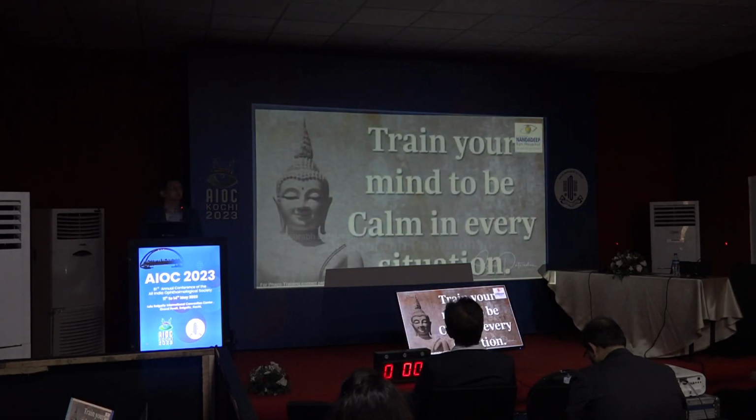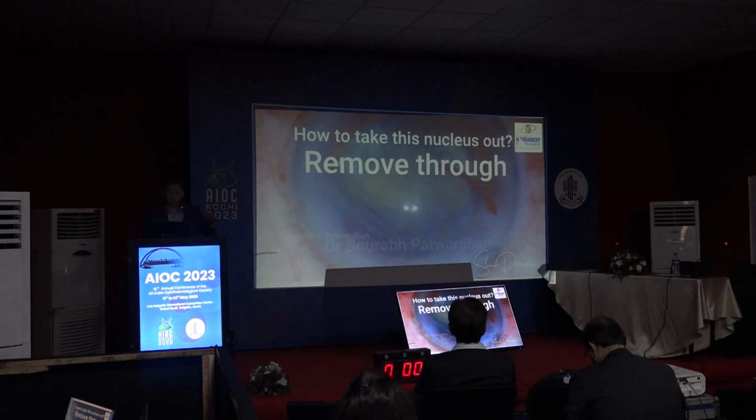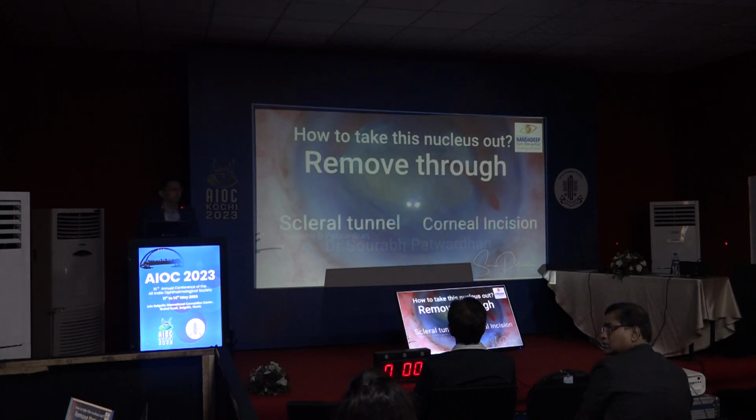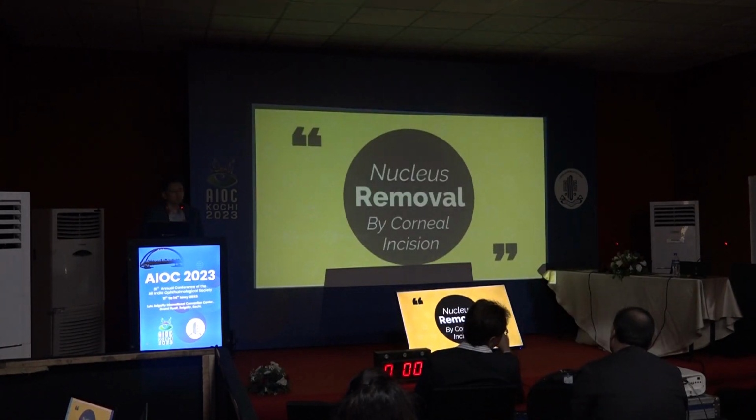So first thing is calm yourself. As I said, think that now you have got a new case in hand. Don't think about the first case where you were expecting nothing to go wrong, but think of a new case in hand. So first thing is how to take the nucleus out. So we have two options. Either we can take it out through the scleral tunnel or through the corneal incision.